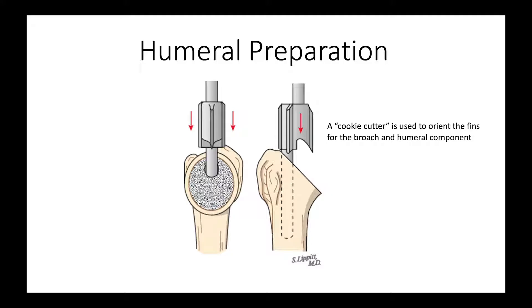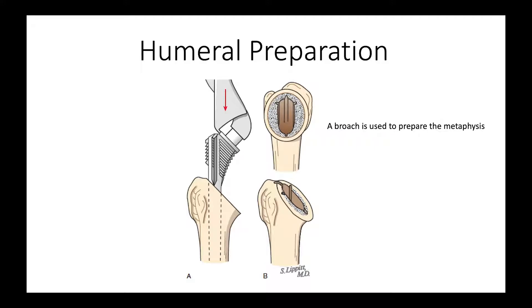We use a cookie cutter to orient the fins for the broach and for the humeral component. Then following that, we use a broach that has a similar configuration to prepare the metaphysis for the component.